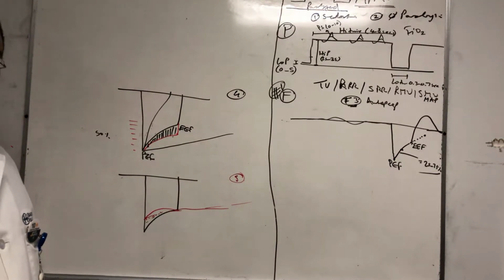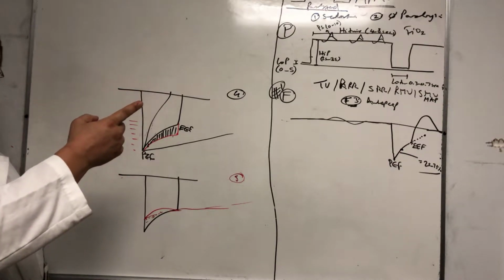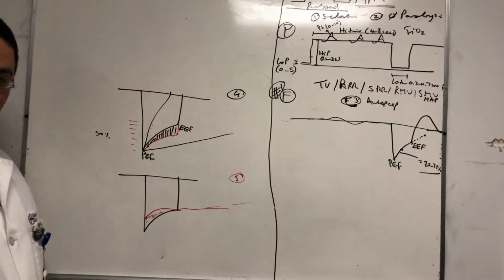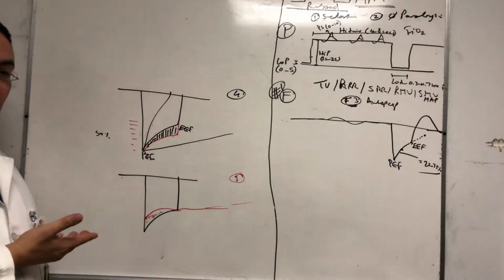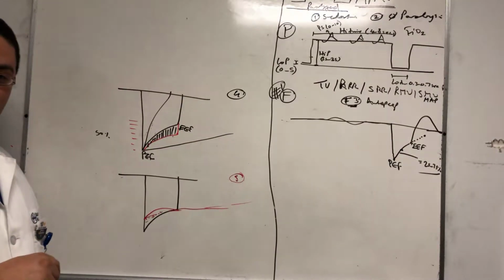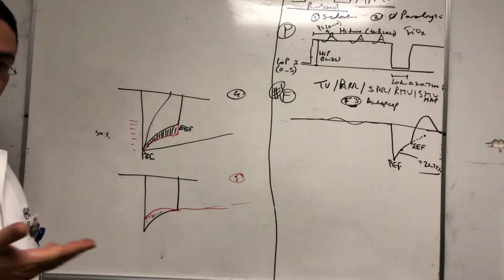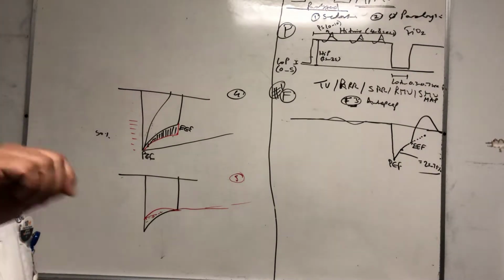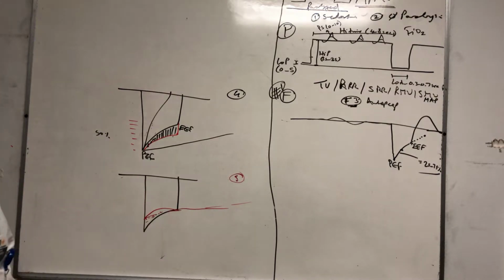Huh? This one, we're actually maintaining a pressure of like 35 for 6 seconds. Not the PEEP 8 and 10, and we're talking about 8 and 10 and stupid numbers like this. We're talking about a huge number of pressure, maintaining it for a long period of time. There's no muscle that will overcome this pressure inside the airway. So you won't ever hear bronchospasm, and that's another claim to fame to this one. That's why it's very rare to see it. The only time you'll see this is if there's an upper airway obstruction, like a mucus plug or a kink of the tube or something like that. But you're not gonna see it with just bronchoconstriction.